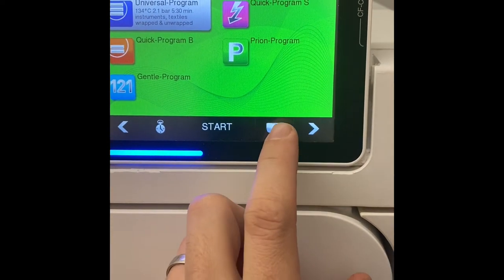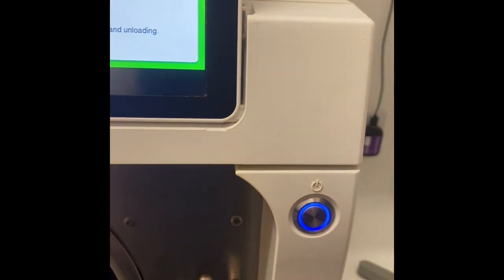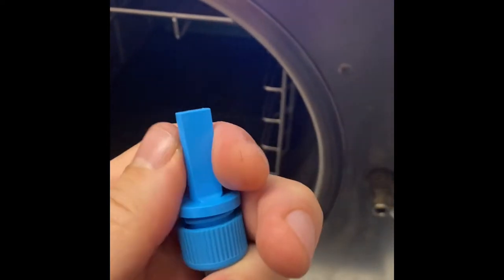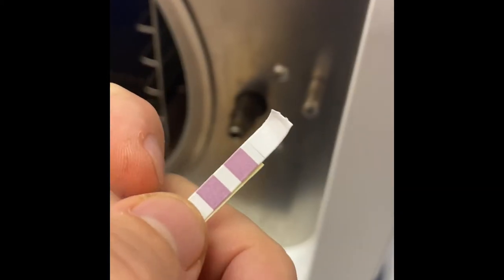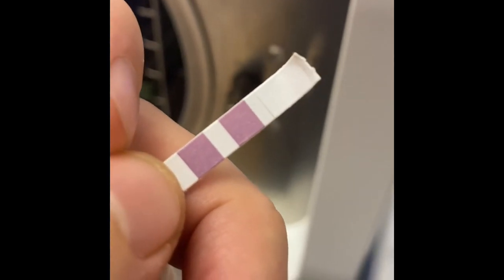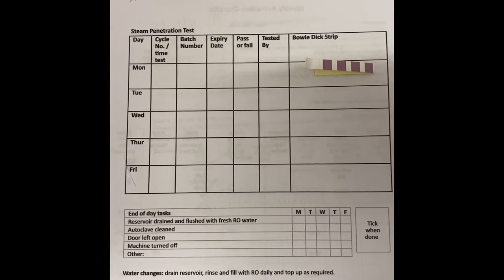For the sake of the demonstration, we're going to pretend the cycle has fully run. Once the cycle finishes and the door opens, we very carefully turn this out because it's going to be hot, and then carefully unscrew the little cap. Leaving that little tag just a bit long helps because you can grab it. When we take this little tab out, it should have changed to a light green colour. If it's not changed to a light green colour, the vacuum test has failed, and we need to let myself or Nicola know. Once done, we take the little strip and securely tape it to the day it was tested on.